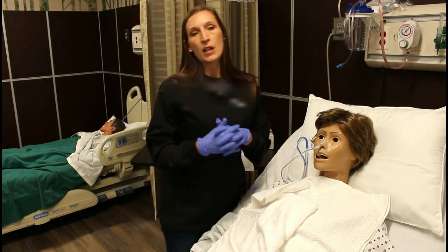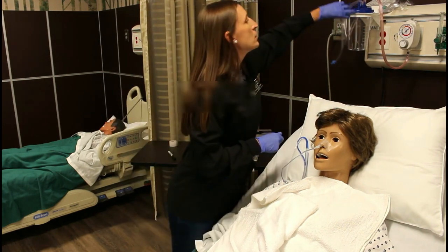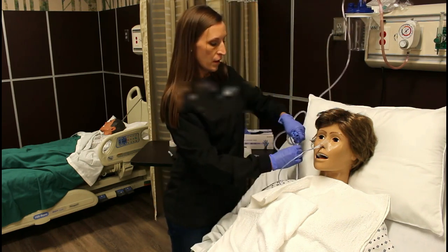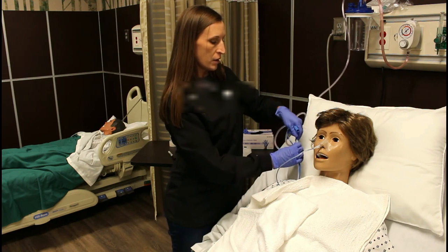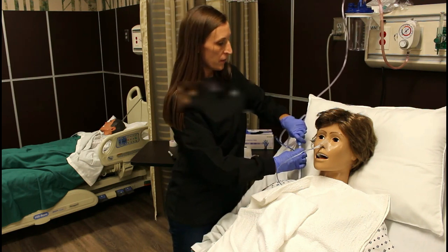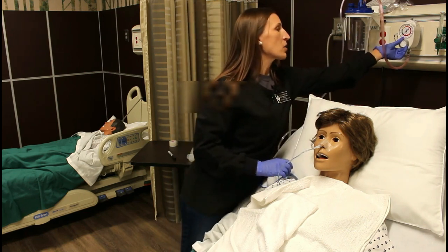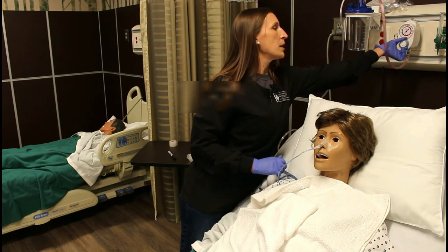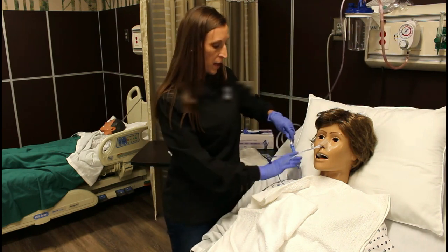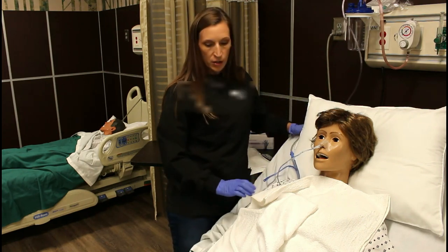After we've done that, we are going to hook it up to suction if that's what's ordered. At this point you'll take off the blue pigtail — that's an air vent. You'll connect your suction and turn it on to low intermittent suction by turning the dial. The blue pigtail should be open. So that's hooked up to suction.